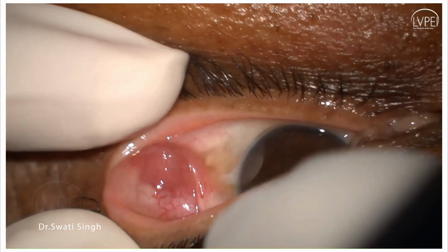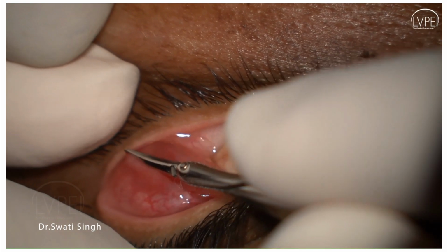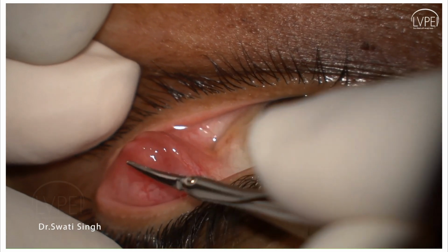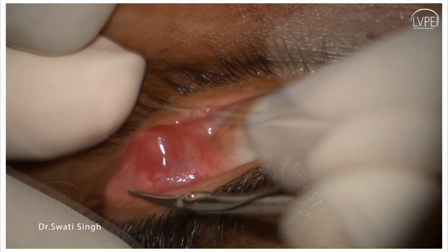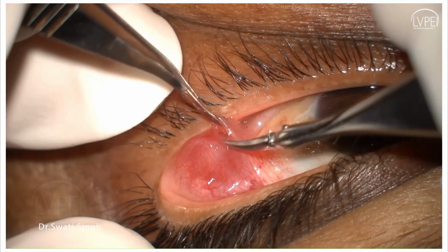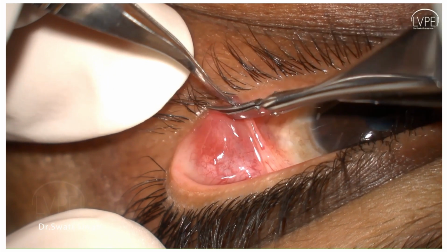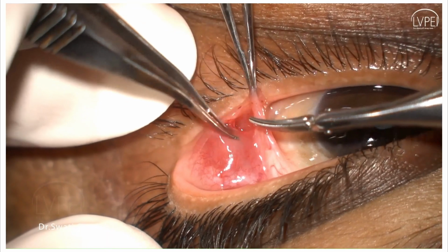Here is an intraoperative video of Dacryops excision which was guided by preoperative fluorescein staining. The patient is a middle-aged female being operated under local anesthesia. The functional ductules of the lacrimal gland were identified above the lesion.